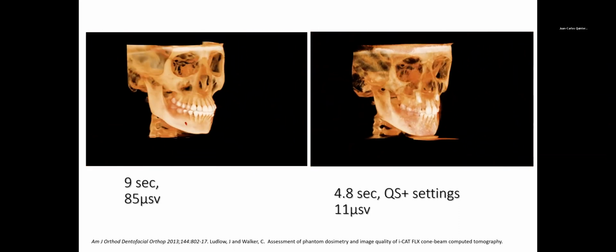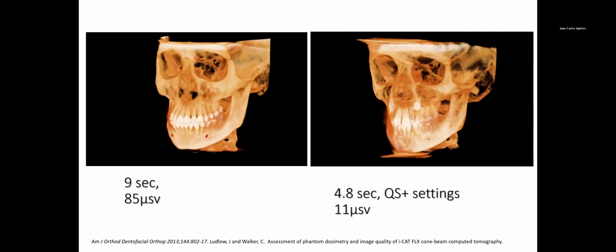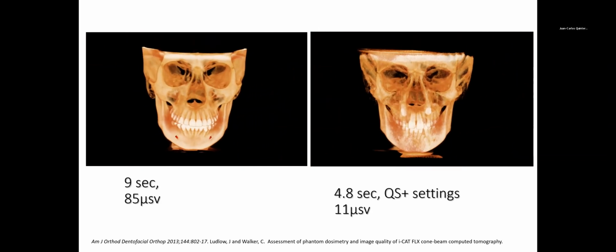Now, these dose levels, it's very important to understand the scientific evidence behind these numbers. I'm not just throwing numbers out. These are values that have been studied, and here's the reference. It's Ludlow, who's probably the premier researcher on dental radiation at UNC. So he measured these qualities. So these qualities are supported by the research.